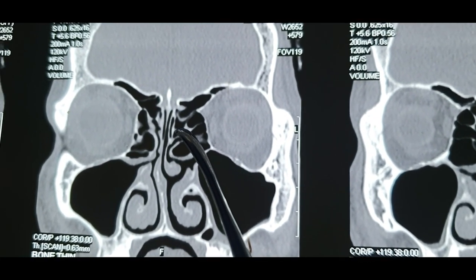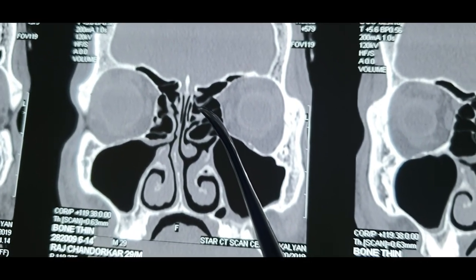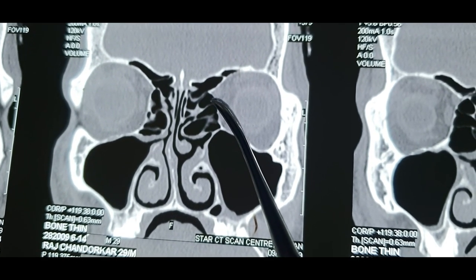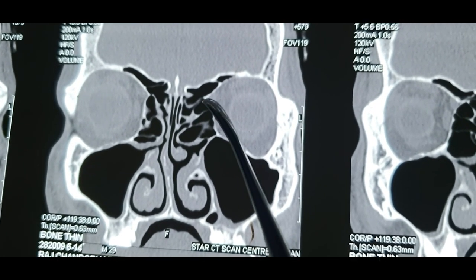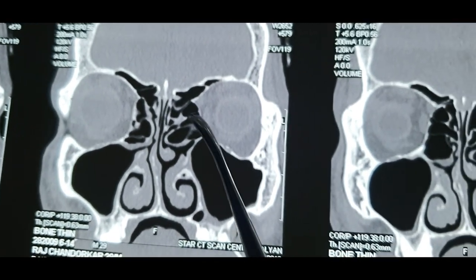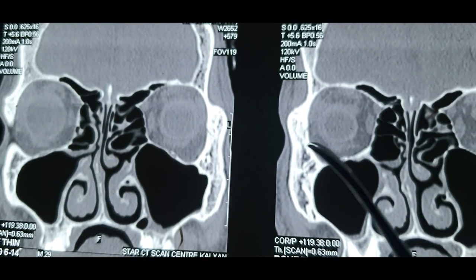Of all the surgeries and skull base dissections over the years, studies have mentioned that the ground lamella is the most consistent landmark for the identification of the anterior ethmoidal artery. Now, the anterior ethmoidal artery runs in the skull base a few millimeters anterior to the ground lamella. So see, this was the ground lamella here, and we are going anterior.